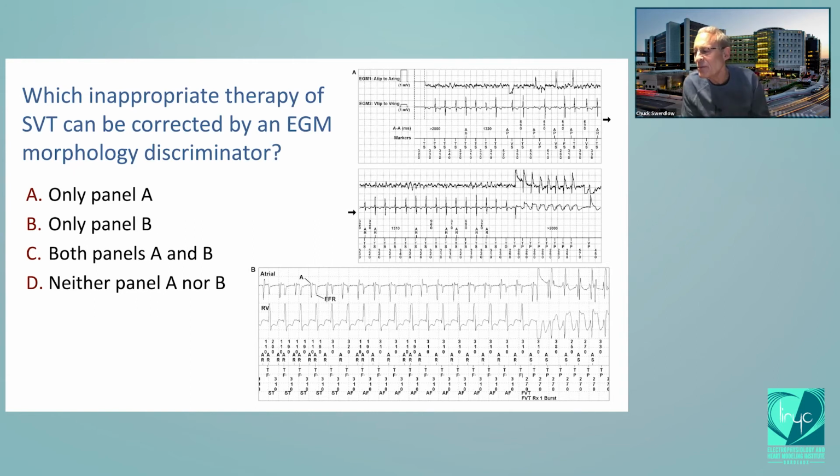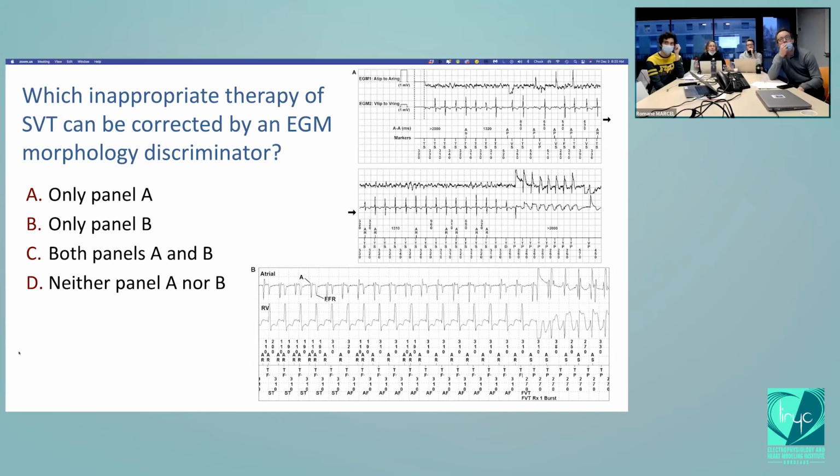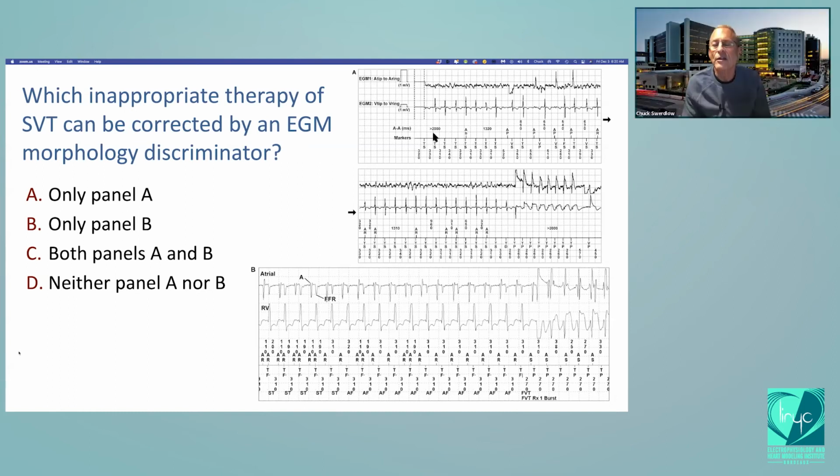How about the Hugo from France? So there is AF undersensing. Yeah. I'm sorry, could you say that again? I didn't hear you. Yeah, I suspect AF undersensing. Exactly right. This is atrial undersensing.